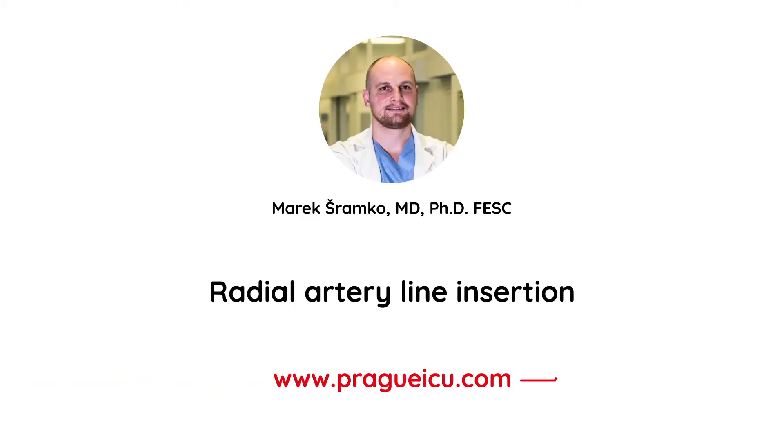Hi, I'm Marek Sramkov from the Prague ICU, and today I'm going to show you how to perform ultrasound-guided cannulation of the radial artery.